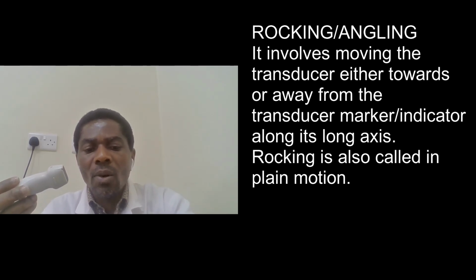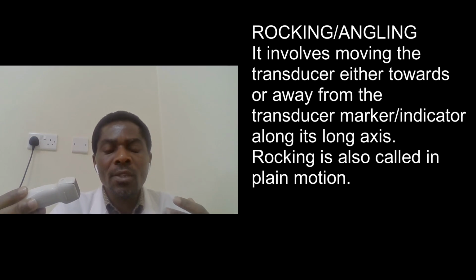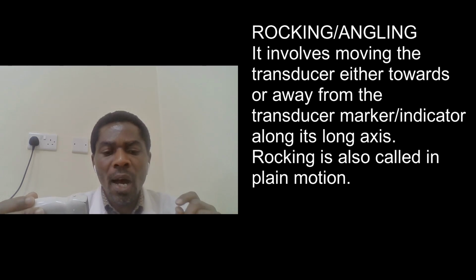Thirdly, we have rocking or angling. Rocking involves moving the transducer either towards or away from the transducer indicator along the long axis.